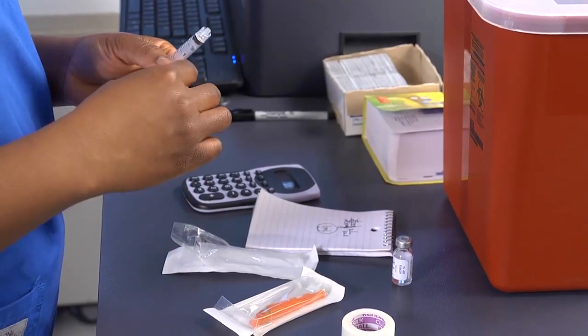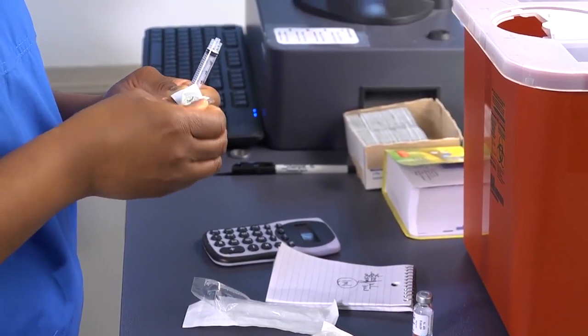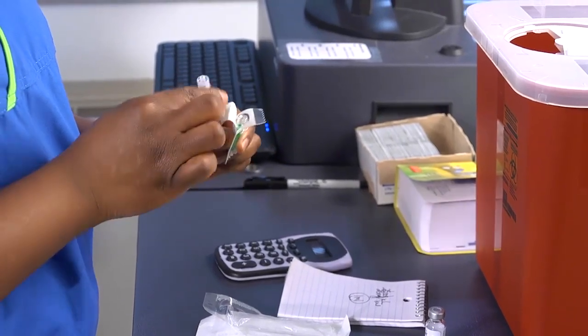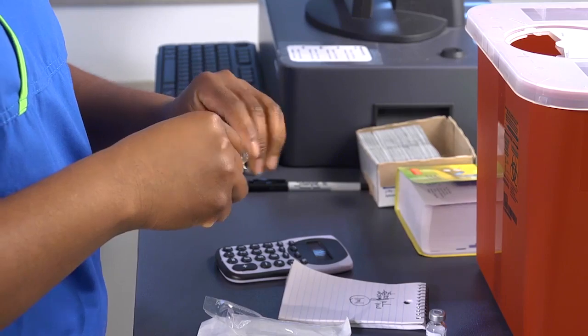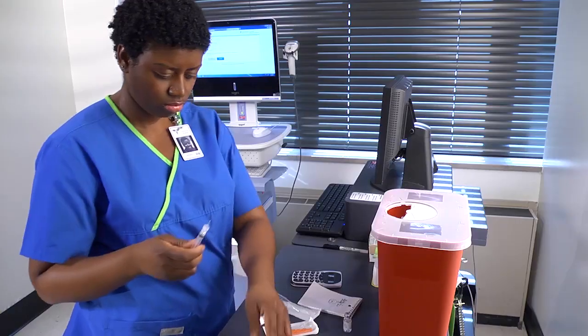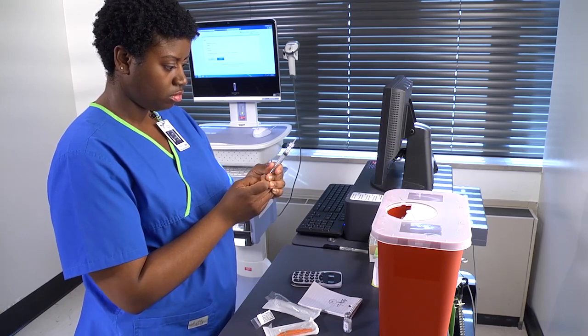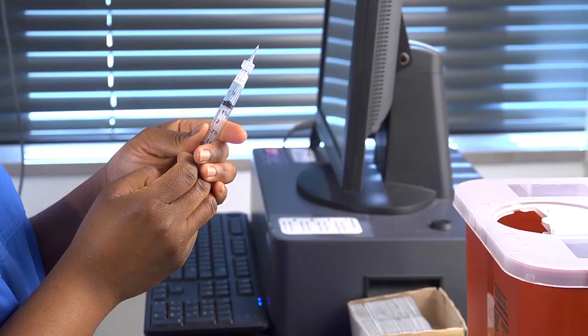A filter needle may be needed to withdraw certain medications from the vial. Review your agency's policy or the drug insert to determine if it's necessary to use a filter needle. This nurse is using a blunt tip needle to reduce the risk of needle stick injury. Then pull back the plunger and draw a quantity of air into the syringe equal to the volume of medication you intend to withdraw from the vial.